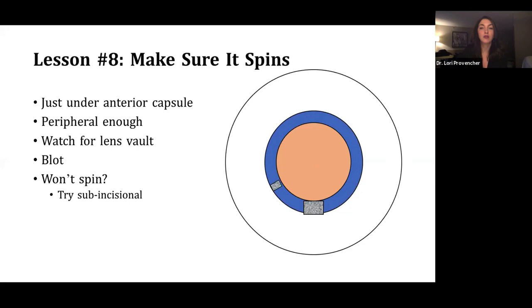You've got your nice perfect rexis here. You're going to go in with your BSS cannula. I always go to the left first. Hydrodissect, you get your color change. Then I go to the right. And then sometimes you still have this sub-incisional attachment, and you really can't spin the lens. And so what I've learned is to just go in through the paracentesis and do a little sub-incisional hydrodissection. And that completes your cleavage, and generally the lens spins really well.